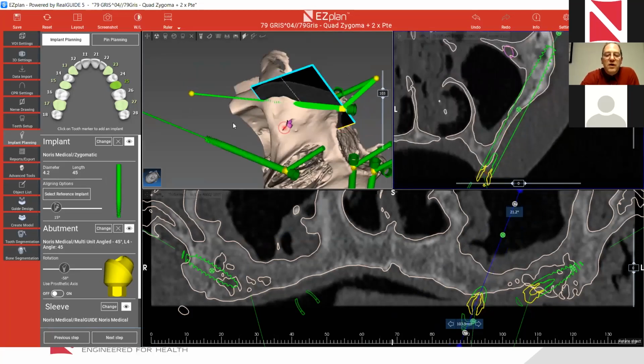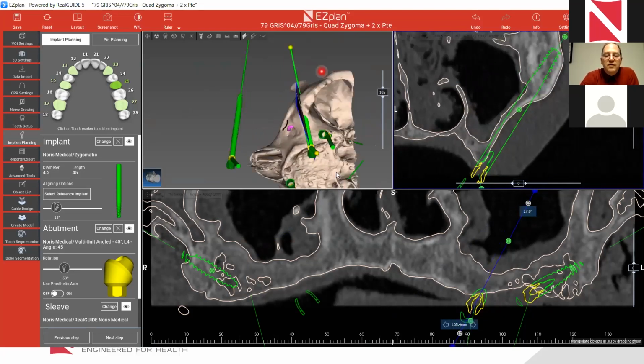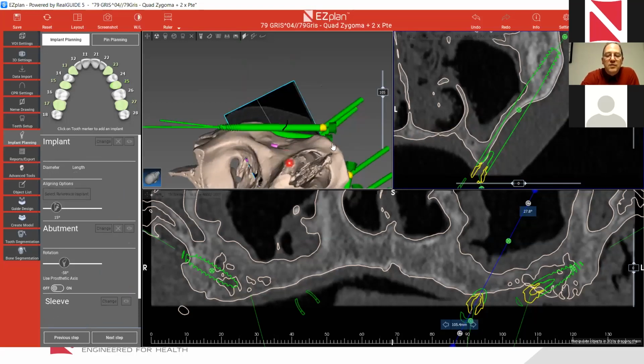From our entering point, no, this is too much. This is too much. Let's say we put it this way. Okay, like that. Looks fine. Can we or can we not now put an anterior implant? Because once we have this as a fact, we put an implant.